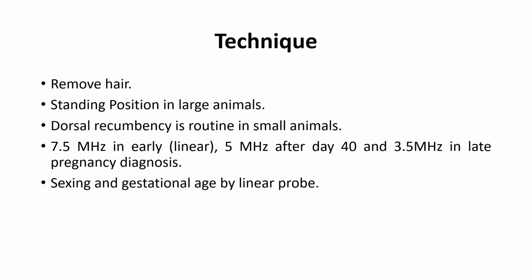Before starting ultrasonography, remove the hairs. In large animals, ultrasonography is preferred in standing position, while in small animals such as small ruminants, sheep, goat, dogs, and cats, dorsal recumbency is preferred.